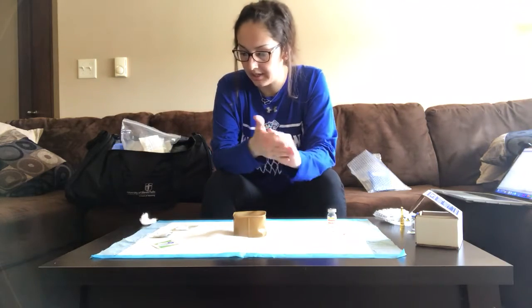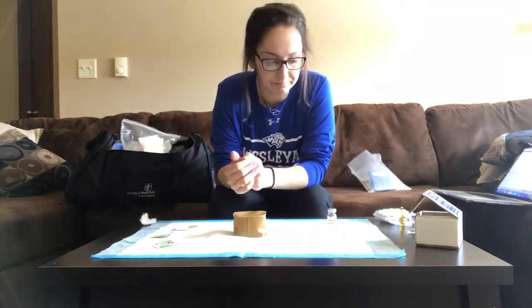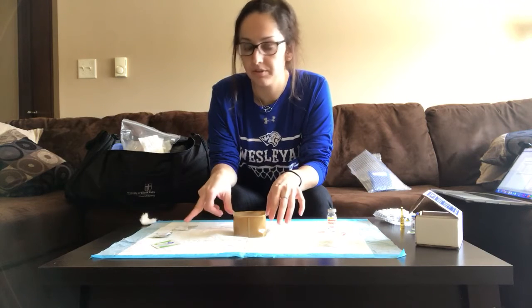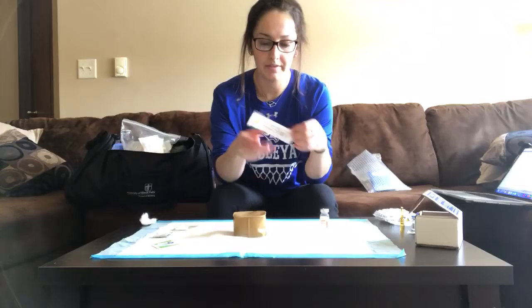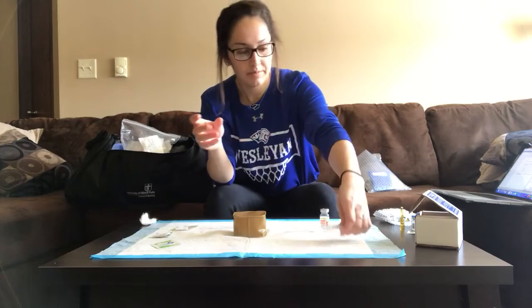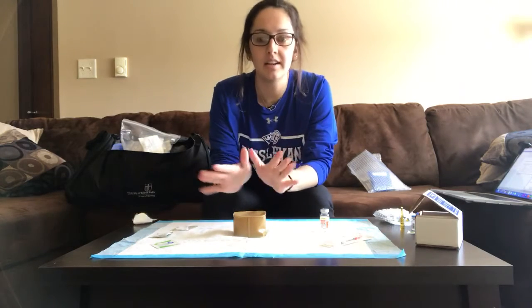And then I have hand hygiene before I start anything. After I walk into the room, I will perform hand hygiene as I'm identifying the patient, introducing myself and whatnot. Okay, so then I'm going to set up my station. I have a few alcohol swabs, or alcohol wipes here. I have my insulin vial, and I have a 50 unit insulin syringe with the attached needle. I also got some gauze and some tape, and so then I got everything set up.